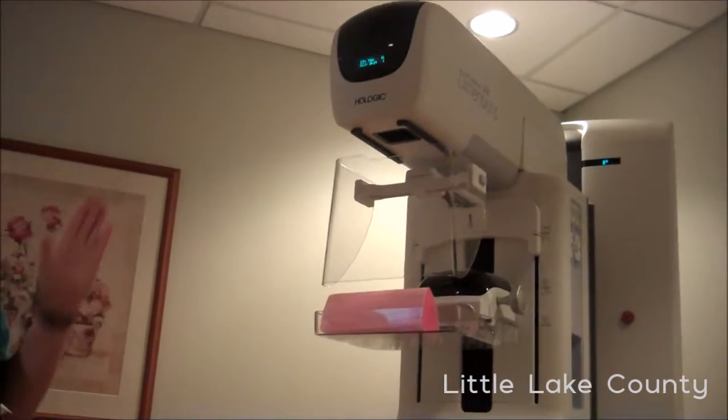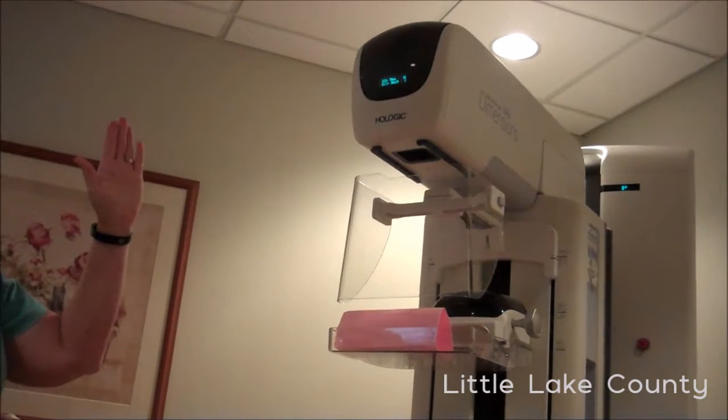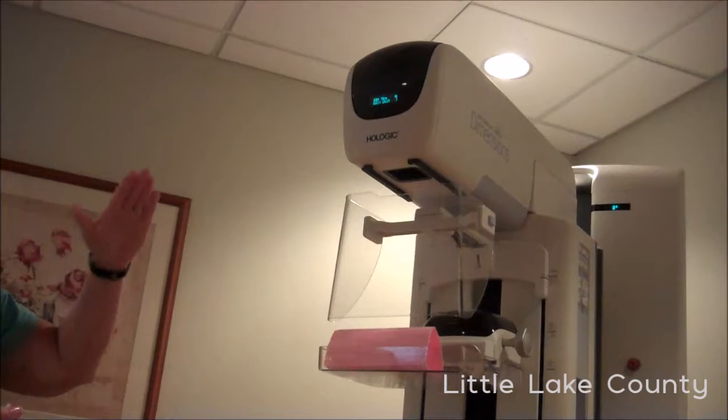At first, I'll have you stop breathing. The tube's going to move this way, this way. I'll have you breathe as it comes back to the center. And then I'll have you stop breathing because it's going to take a straight-on picture. It's going to be fanning the tissue, the breast tissue as well.